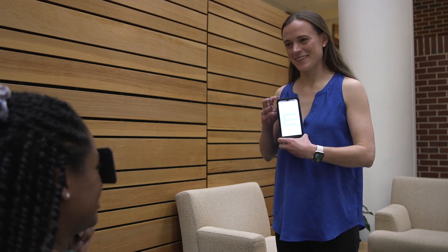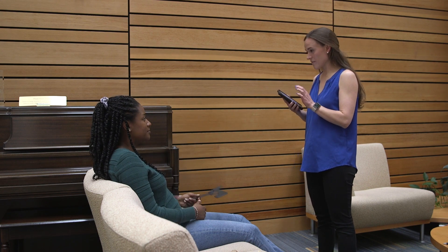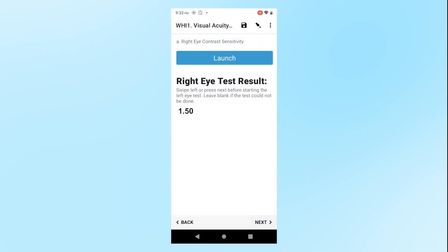Even if the participant has to skip some letters, the exam will continue until it has calculated a score for the participant and you hear the final noise. When you have completed the exam, look at the phone and confirm that you see the right eye score recorded on the ODK page. This will appear as a number between 0.00 and 2.10 after the words right eye result. Then press Next in the bottom right corner to move on to the left eye.